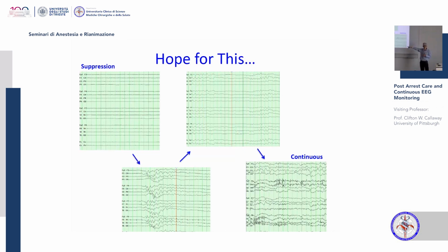Burst suppression, I will maintain, despite that first slide, is not a highly malignant pattern if this is when you see it.